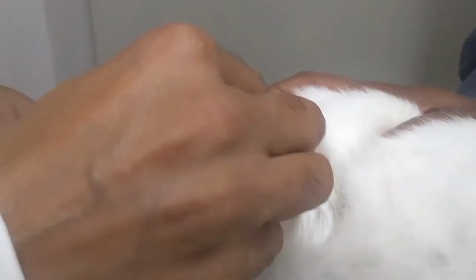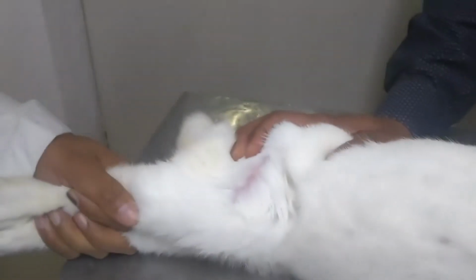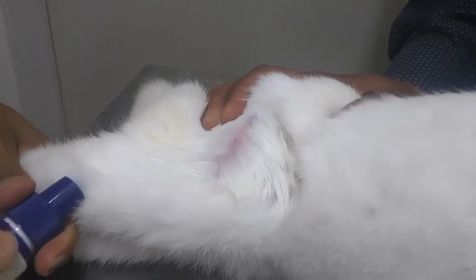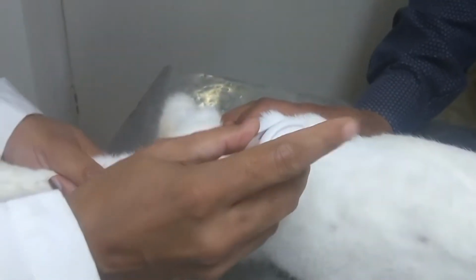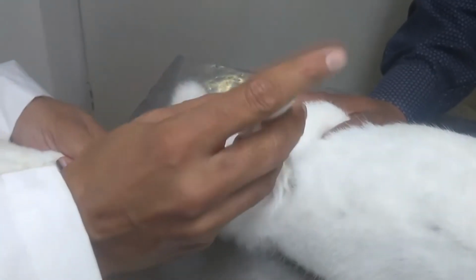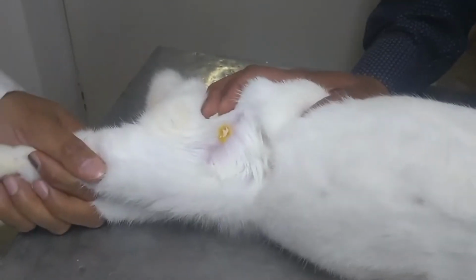We have taken it out, clean the area again, and then we apply some antiseptic powder. Here it is betadine powder, so that infection cannot develop later on. We sprinkle some of it at the area of injection.